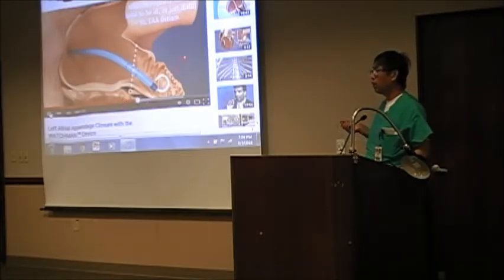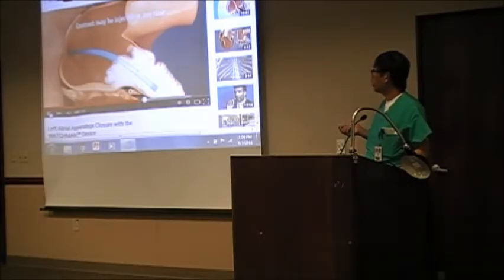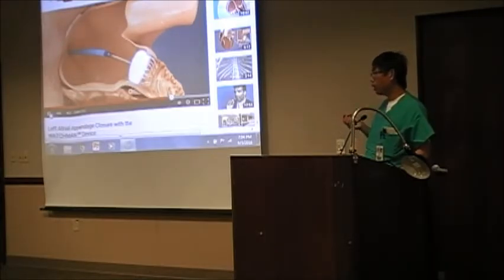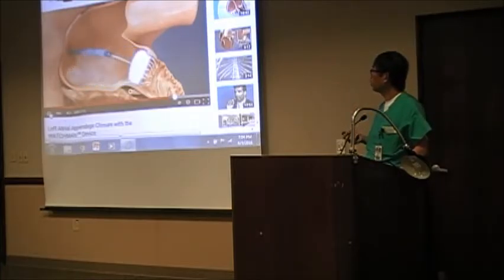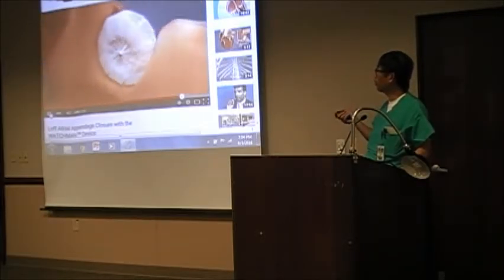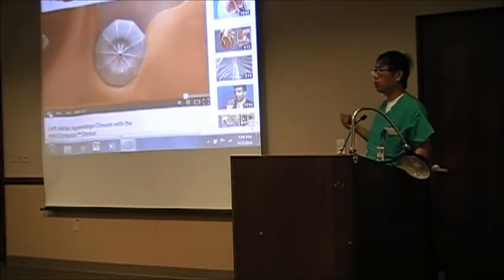And then you measure with the TEE or intracardiac ultrasound to see how big they are, and then you choose the sheath. You do the angiogram to give the whole shape of the appendage. And then you put the Watchman device in there. You pull the sheath out and the device expands. Then you pull back a little bit, the hook will be attached to the tissue. And you do the angiogram, make sure it's sealed and there's no blood coming through. TEE also can confirm whether there is blood flow or not, and then you cut it and it will deploy, and the procedure will be finished.